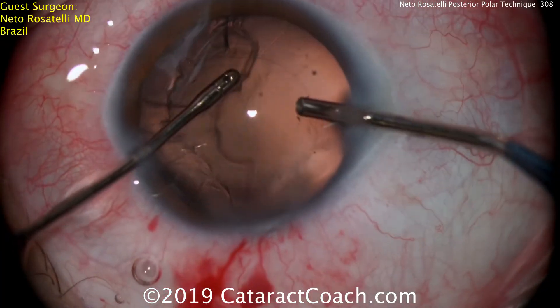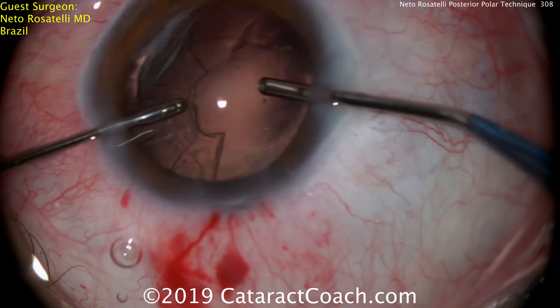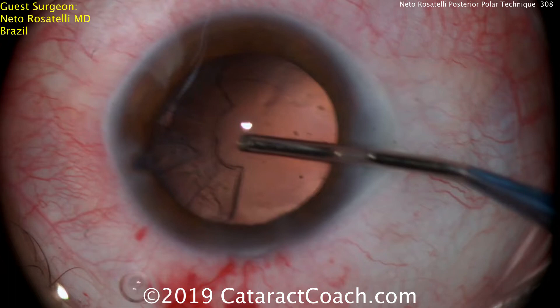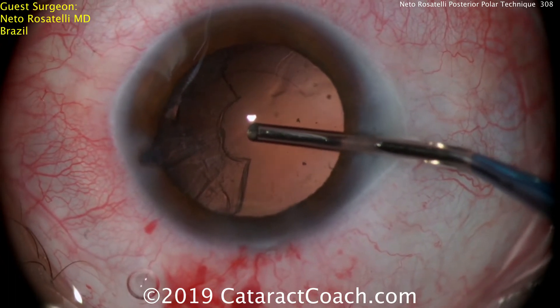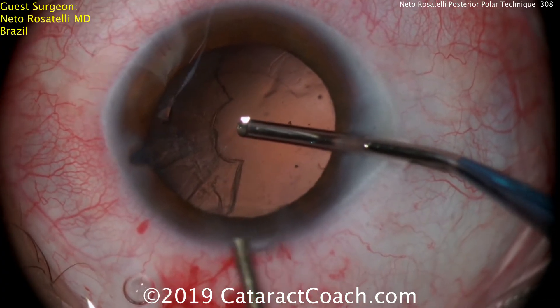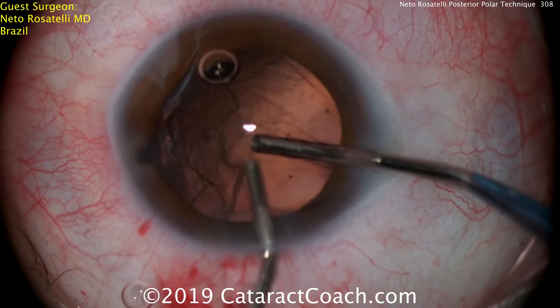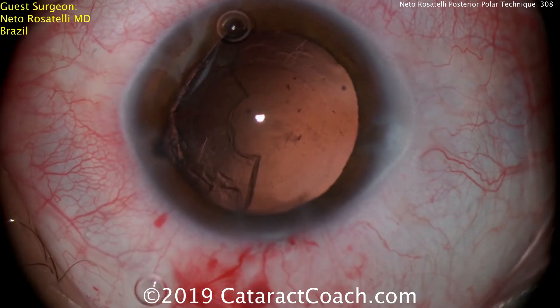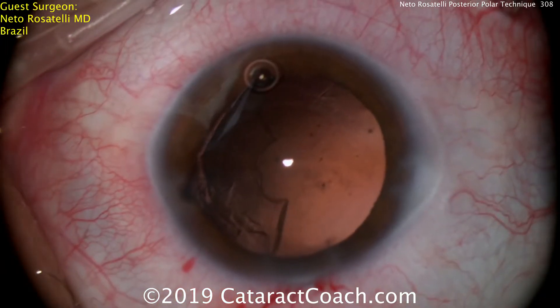Taking out a little bit more cortex. Now the question is — you're going to have to switch hands to access the other part, so what should we do? Well, the old saying is viscoelastic is much cheaper than vitreous. The smart move is to fill the eye again with dispersive viscoelastic while that infusion is in the right hand. Now the infusion can be pulled out of the eye and the hands can be switched — the aspirator in the right hand and the infusion going in the left hand.